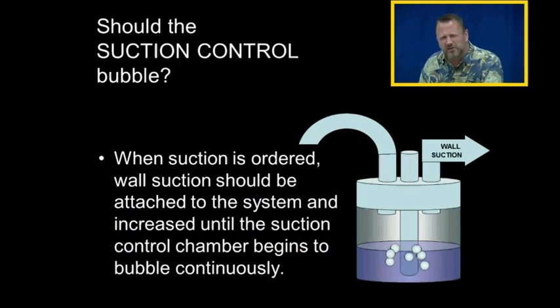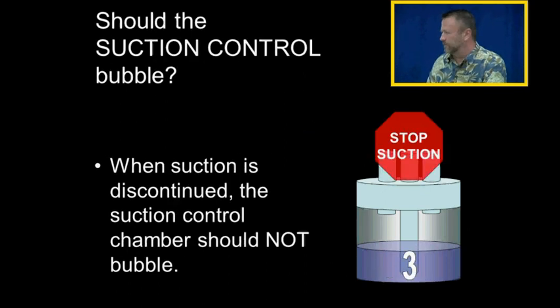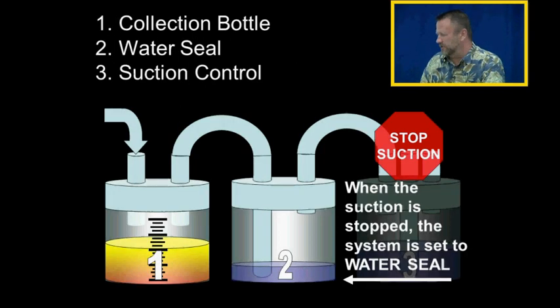So should the suction control bubble? When suction is ordered, the wall suction should be attached to the system and increased until the suction control chamber begins to bubble and bubble continuously. When the proper amount of wall suction is applied, the suction control chamber should bubble. When suction is stopped, the suction control chamber should not bubble. When suction is stopped, the system is set to water seal.